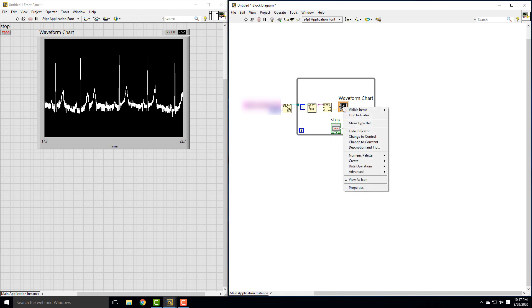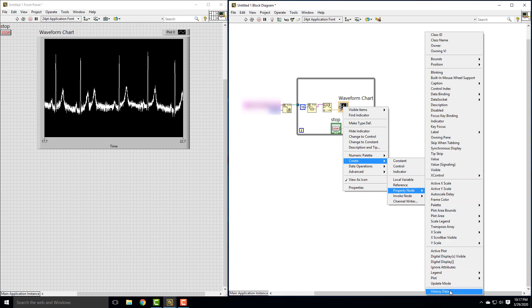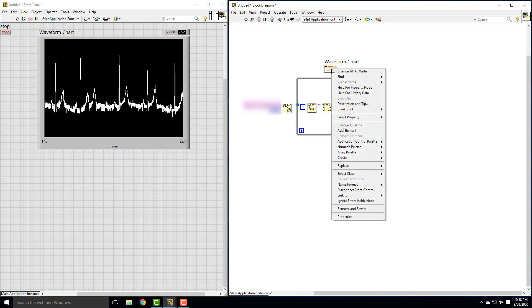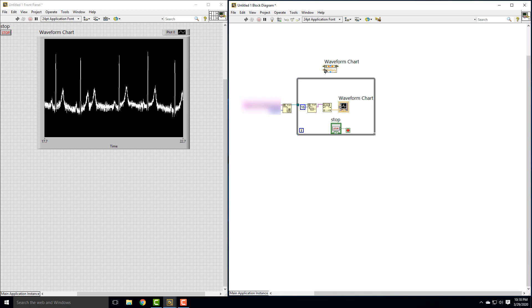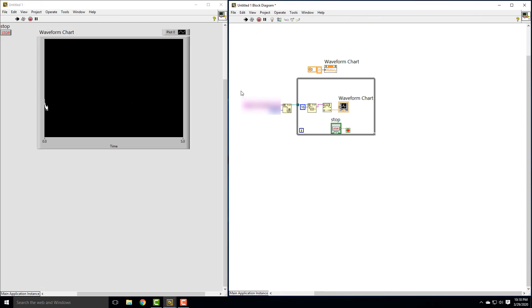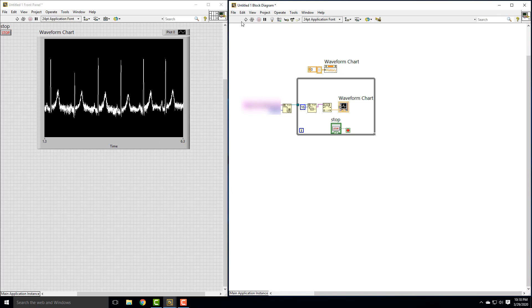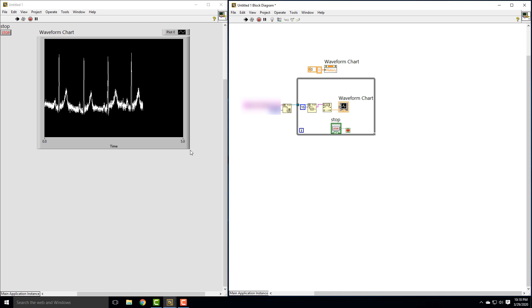You can right-click the waveform chart in your block diagram and go to Create. We need to create a property node for history data. We want to set our history data to zero before this thing starts, so it always starts at zero. Right now this is an output; I need to change it to an input so I can set the history data to zero. I'll right-click and say 'change to write,' making it an input. Then right-click on history data, create a constant, and set it to zero history data. It's not visually connected to the chart, but it technically is. Now if I hit play, we always start back at zero — I'll let it run, then hit stop, hit play again, and it goes back to zero.